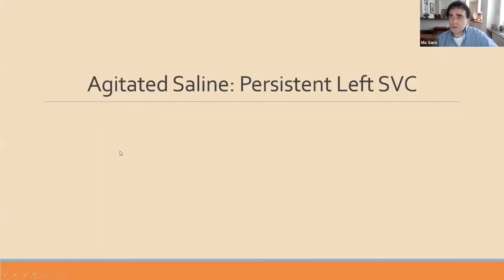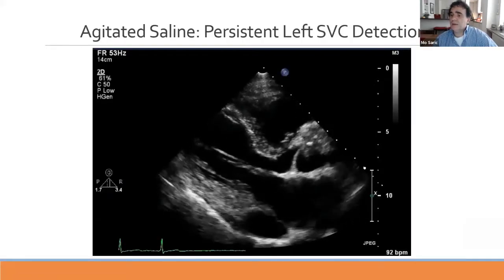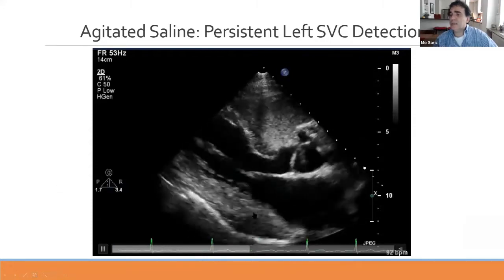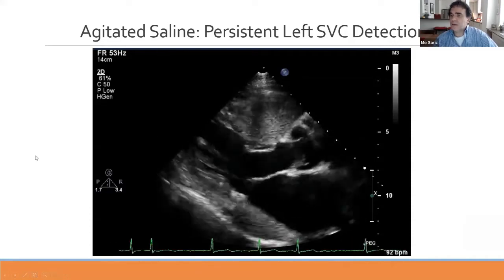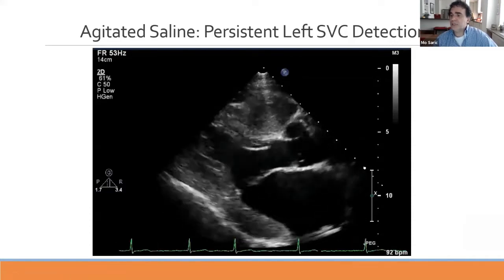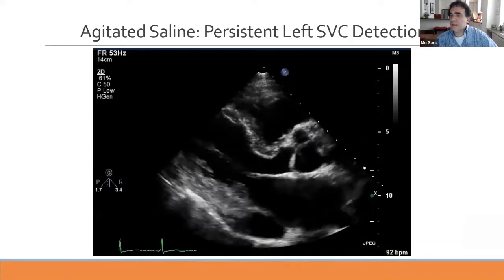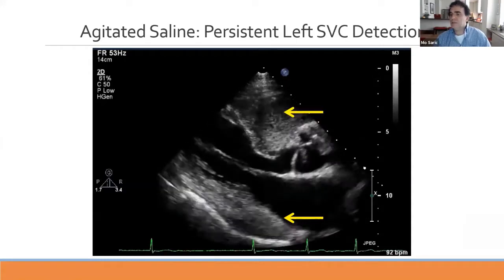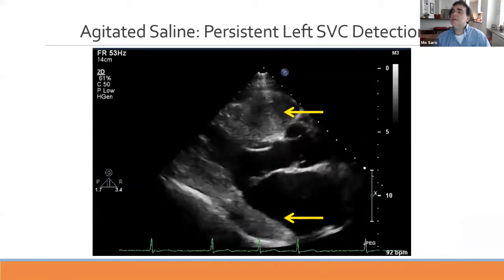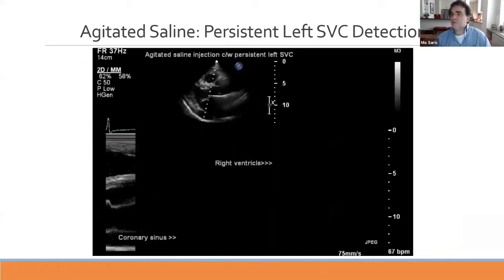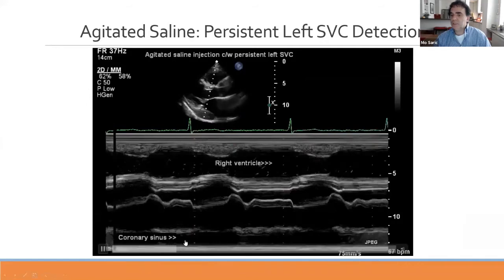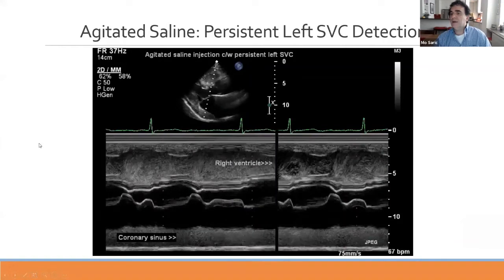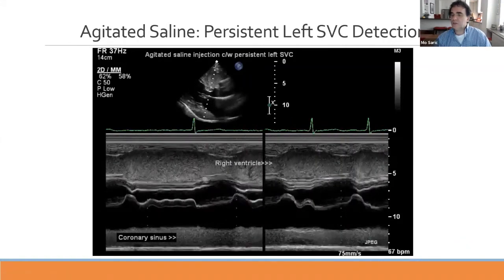Another use of agitated saline is demonstrating persistent left superior vena cava. The bubbles show up first in the dilated coronary sinus and then in the right heart. On M-mode, the coronary sinus opacifies first, followed by the right heart—a pattern very characteristic of persistent left superior vena cava.